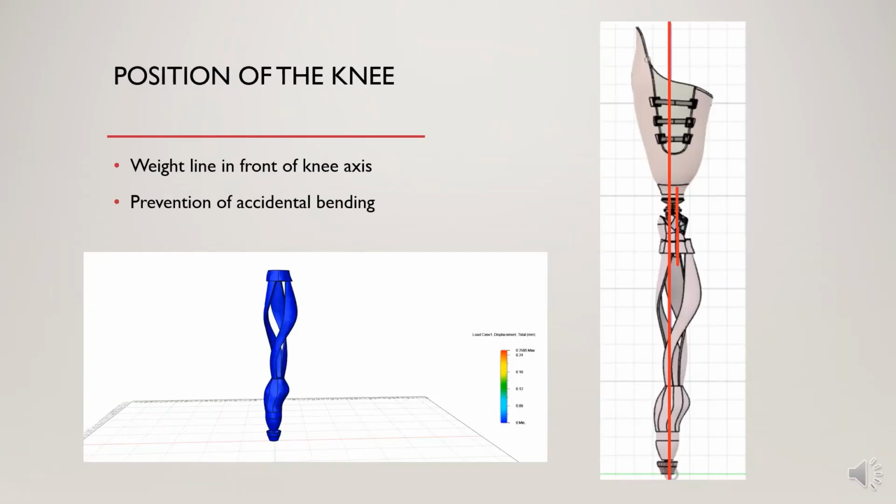The socket, the knee, the spring and the bearings were imported components. The knee should be positioned 1 cm behind the weight line to prevent any accidental actuation. Performing a static loading simulation, I saw that there is only a small amount of displacement, which is good, as it would withstand while still providing some compliance.